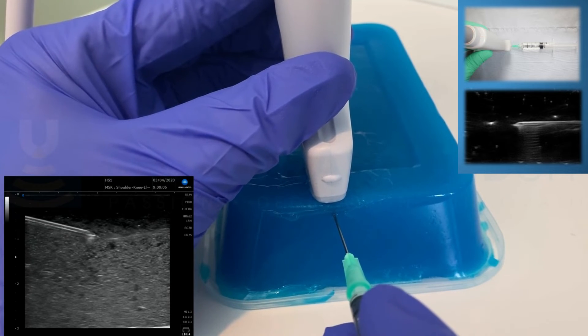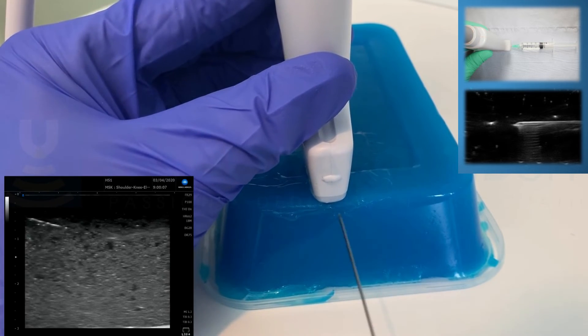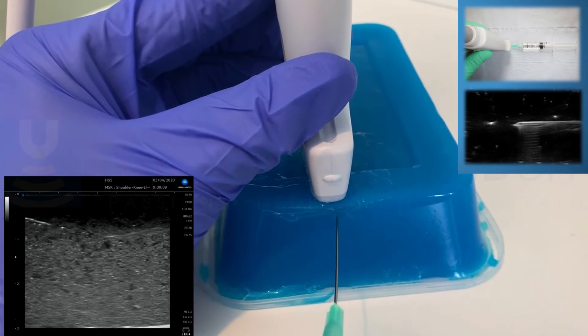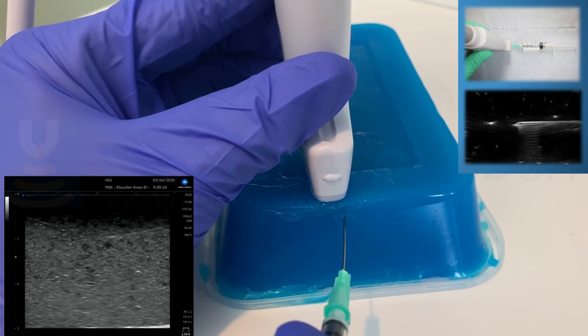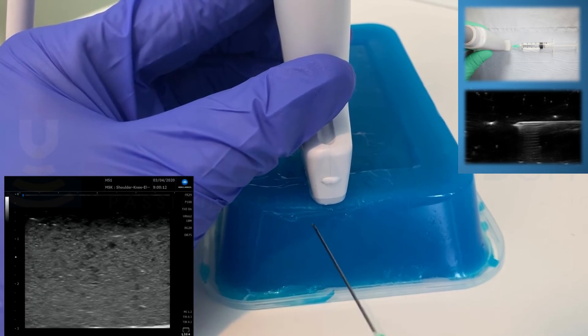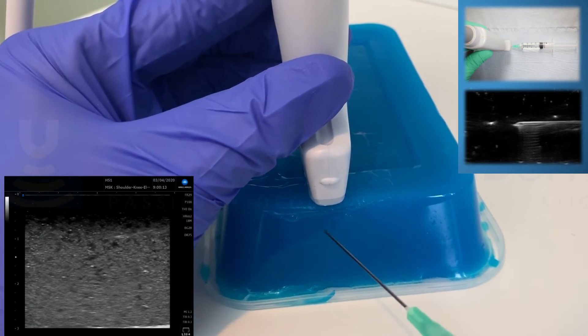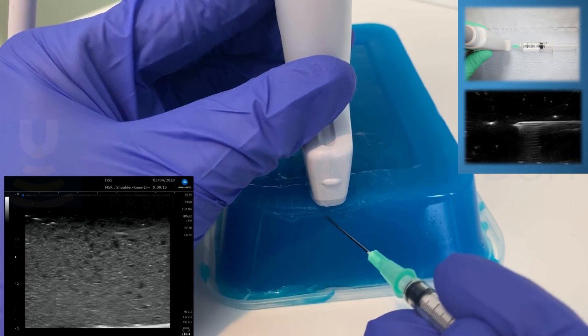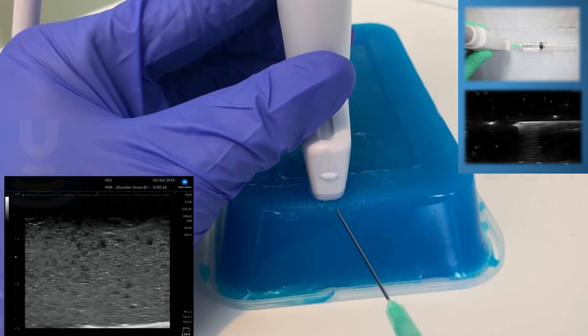If the needle is inserted away from the probe, oblique to the probe face, then it won't be seen on the screen.